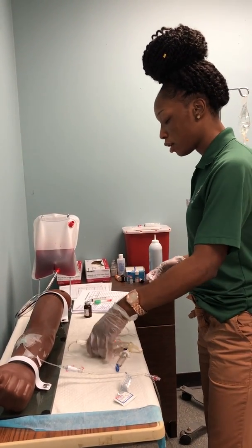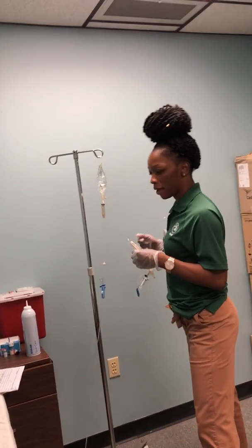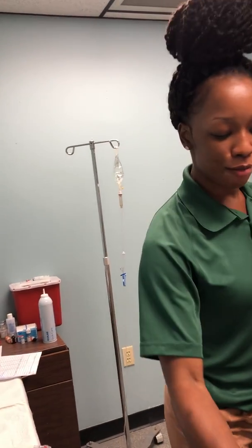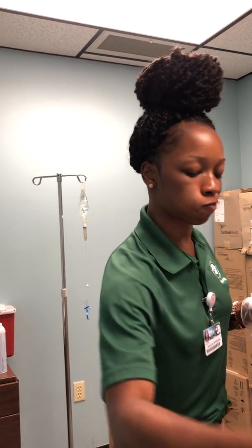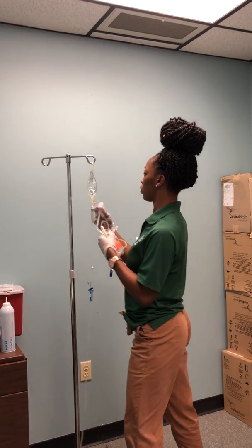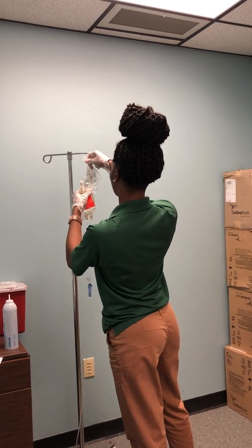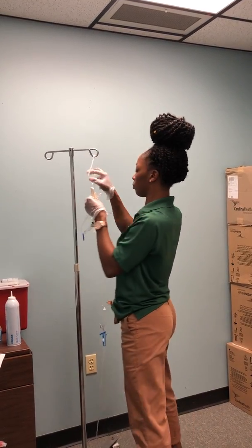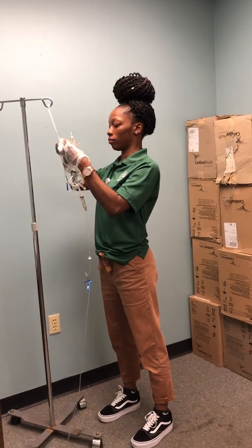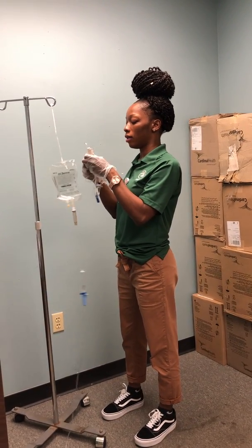Then I would start by lowering my primary bag. And hanging my piggyback.